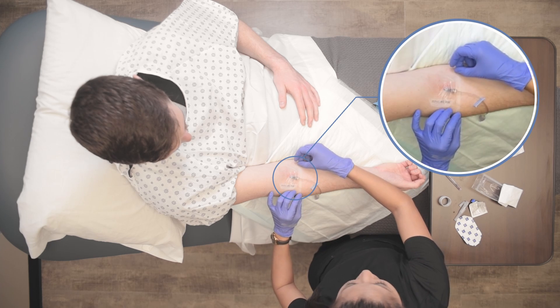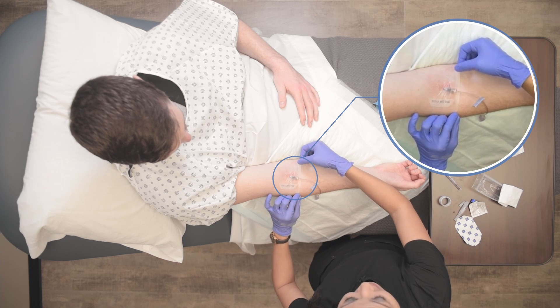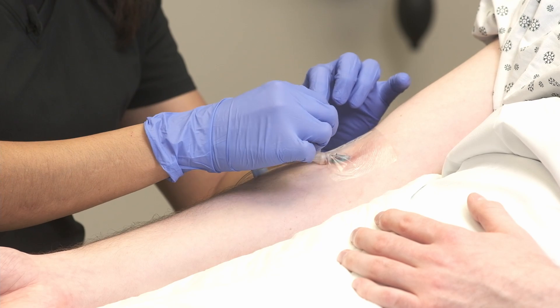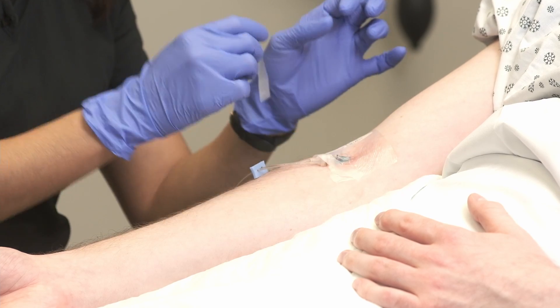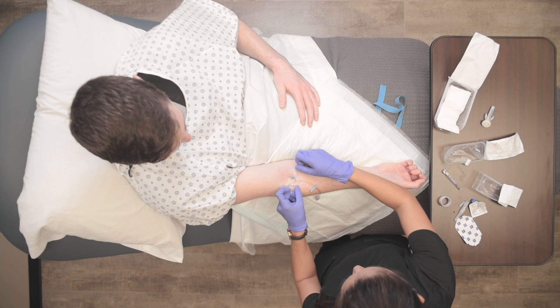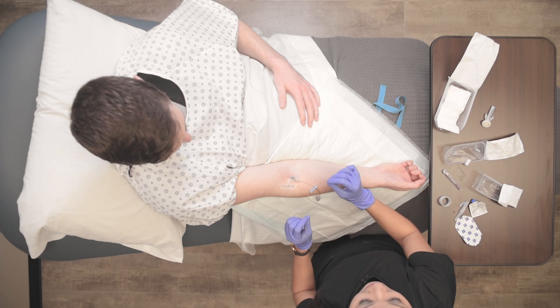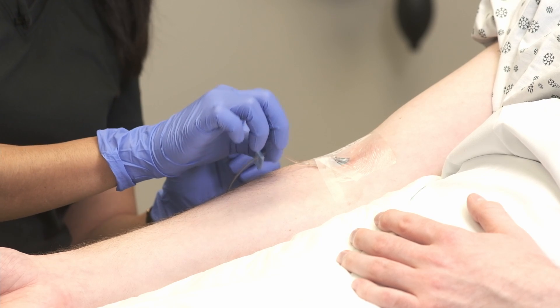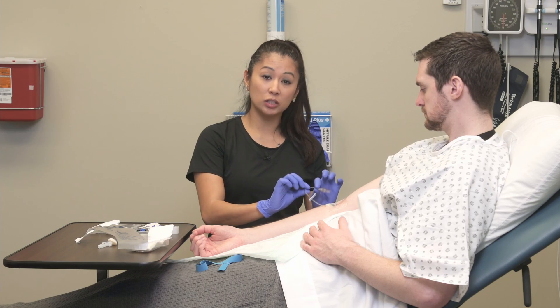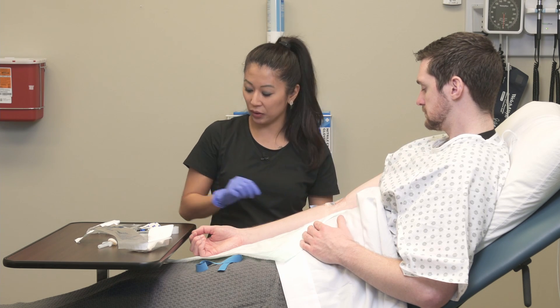Notice my IV is already in, my insertion site is covered, and nothing is underneath that transparent dressing. I'm going to crisscross this tape here — cross one side over and cross the other side. Then I'll take an additional piece of tape and put it around where the catheter attaches to further stabilize it. If I tug on it slightly, you can see it's much more secure for the patient. Now I'll also secure the extension tubing so it isn't draping around — we're going to tape it down in place for the patient.